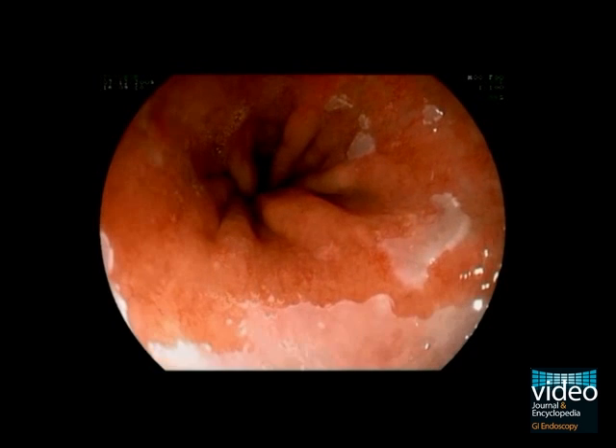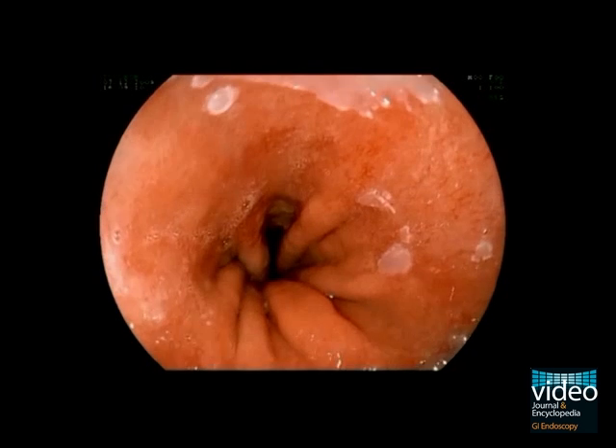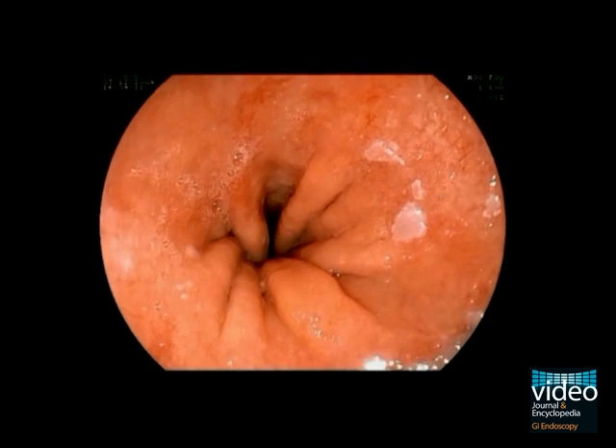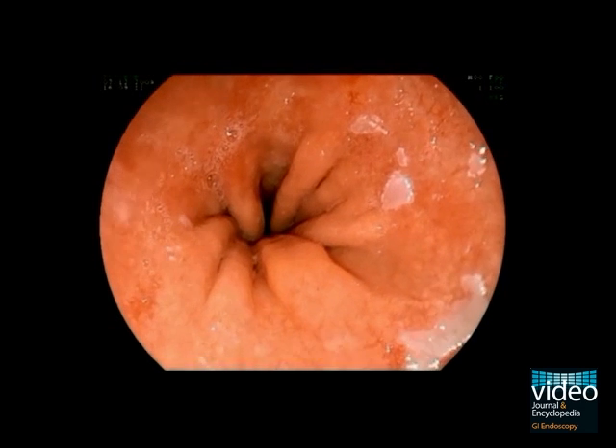This is a gastroscopy in a 55-year-old patient who presented with clinical signs of gastroesophageal reflux disease. After insertion of the endoscope into the stomach, we start a slow withdrawal.